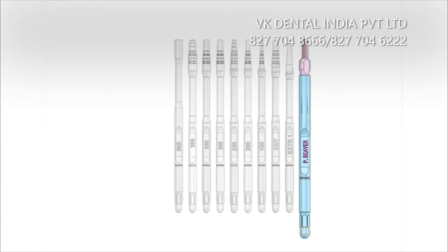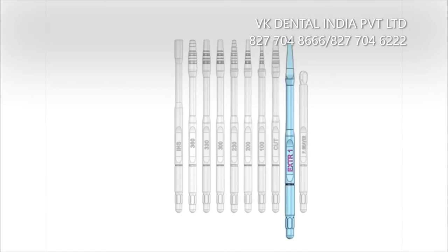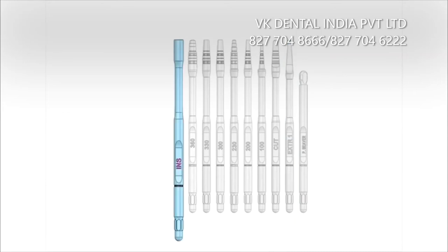Also included are the beaver for the initial cutter of the bone crest, the cutter for the bone expansion technique, the extractor for roots and abutment extractions, and the new concept inserter to easily insert the implant.